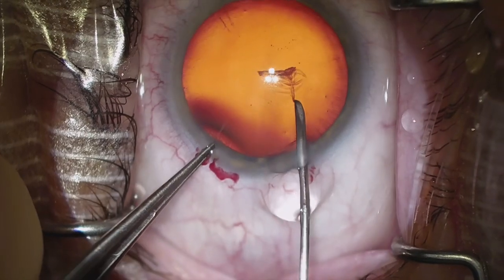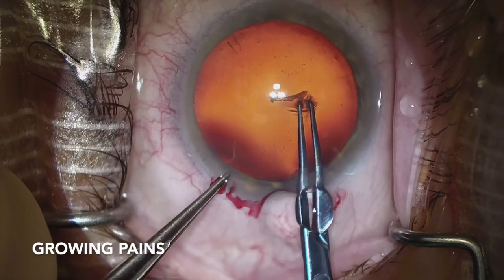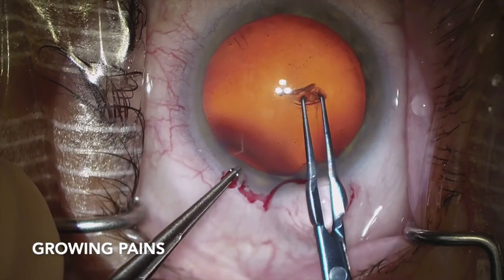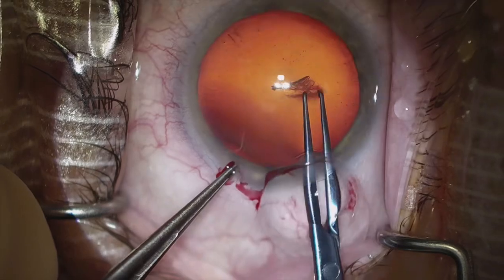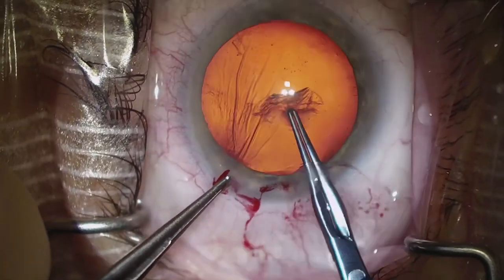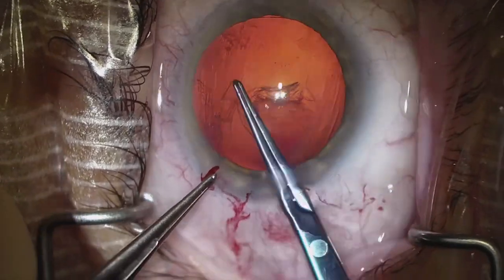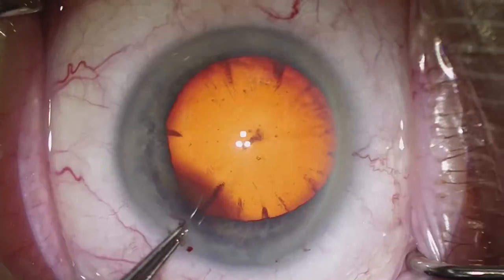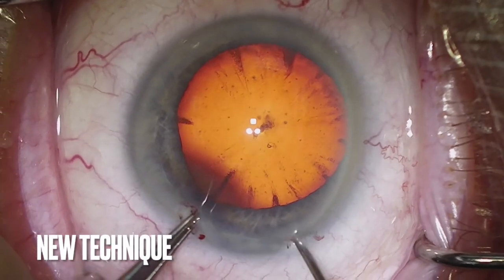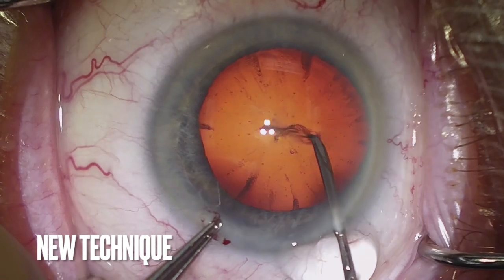So I started experimenting with just making one continuous movement. At first it wasn't always successful — I make just one pass, but the leaflet just really isn't enough here for the Utrata to grab, and I struggle with this case. Eventually I settled on this technique here, which has really served me well for the majority of this year.